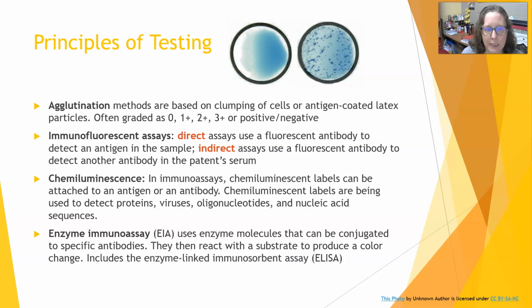They are often graded as 0, 1 plus, 2 plus, 3 plus, or positive or negative reactions. Up here is an example of latex-coated particles, and there's agglutination in this one, so that would be positive. There's no agglutination in that one, so that would be negative.